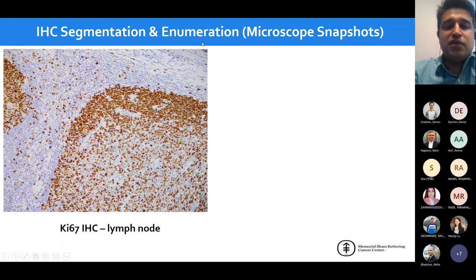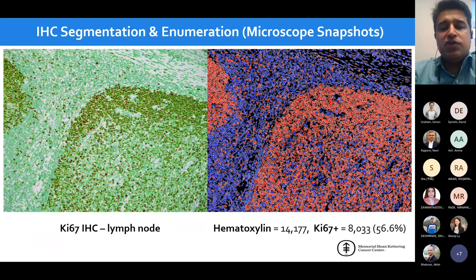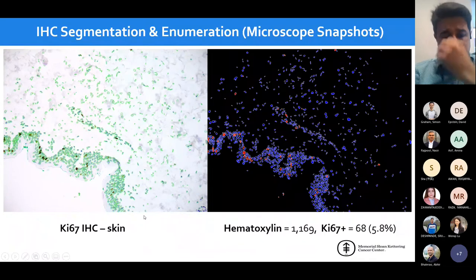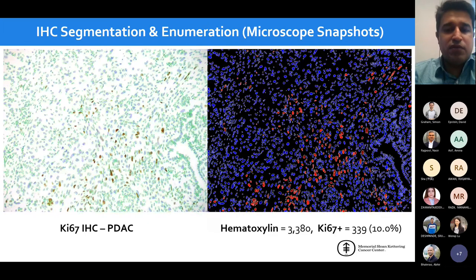So, one thing that we wanted to push for was whether we can have our model sit on an NVIDIA Nano Jetson with a microscope and then readily do, for example, quantification on the microscope itself. So these are the images that we have from the microscope with which we can now directly get high quality Ki-67 proliferation index scoring. And I can get back to this. We have tested it across multiple tissue types, 10 different cancer types, etc. And we are getting pretty stable results on that end.